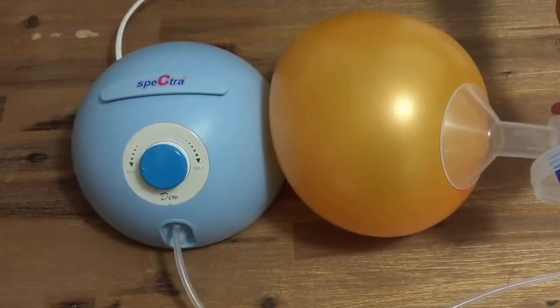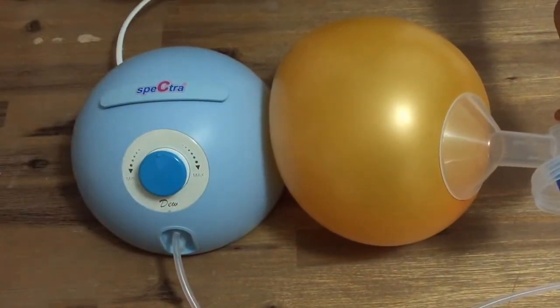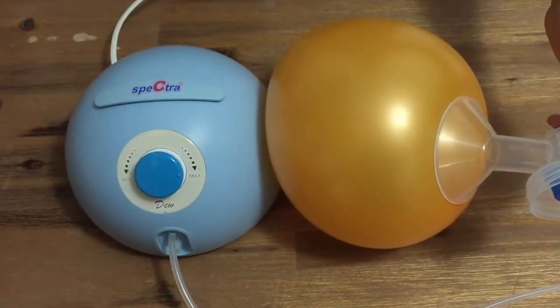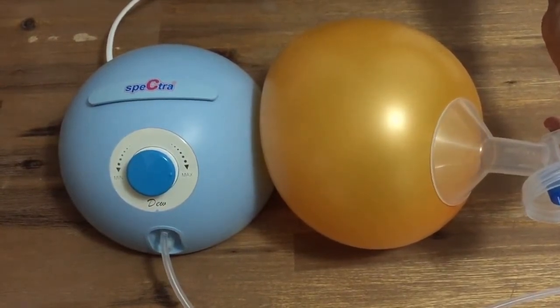Here is the Spectra G350 at the lowest suction setting, halfway, and now at full suction strength. You will notice the speed that the G350 is pumping at does not change as the suction increases.